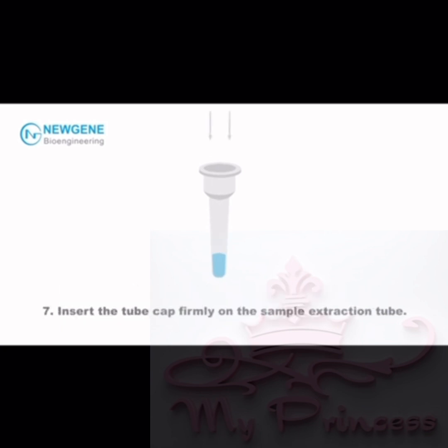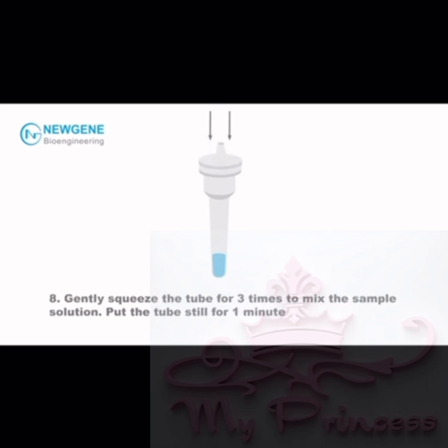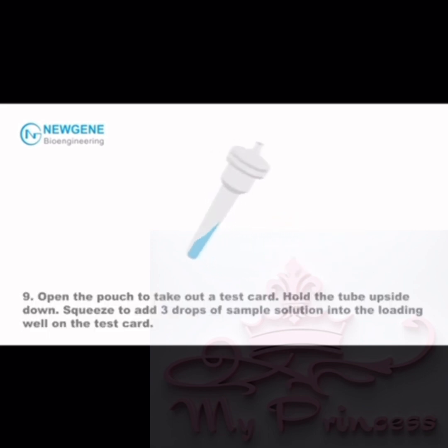Step 7: Insert the tube cap firmly on the sample extraction tube. Step 8: Gently squeeze the tube 3 times to mix the sample solution. Put the tube still for 1 minute.